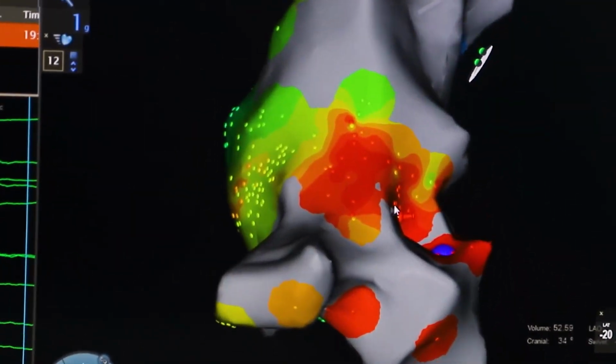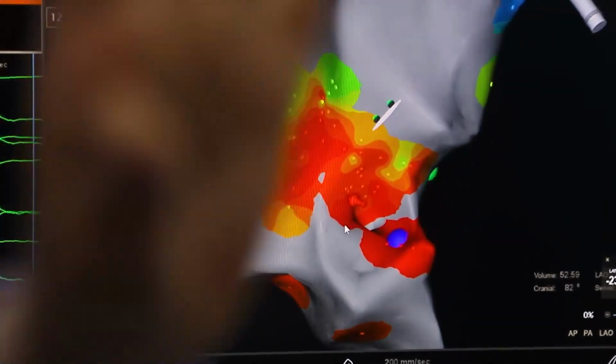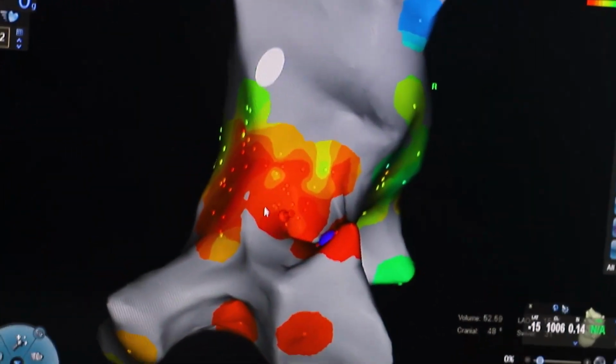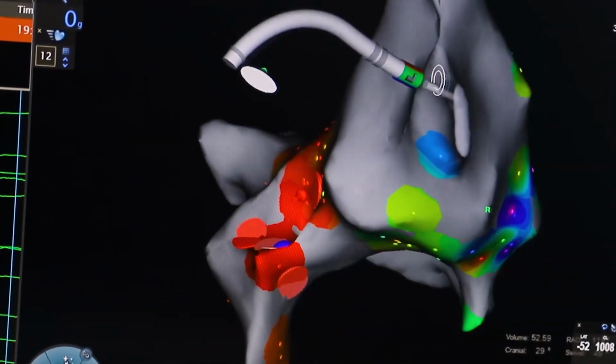Here, the early signal above the cusp. Okay, above the cusp but was 15 milliseconds, not satisfactory. Yes. You gave us 11 and we have 15. Okay. Show us the successful site. The point of, just a moment.